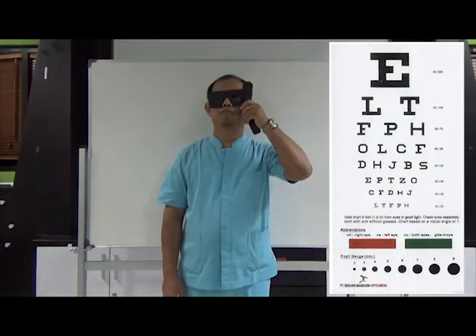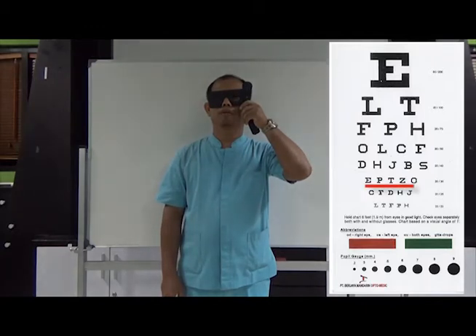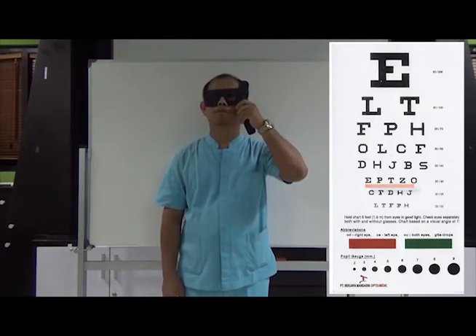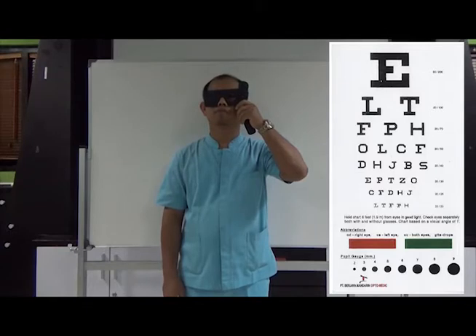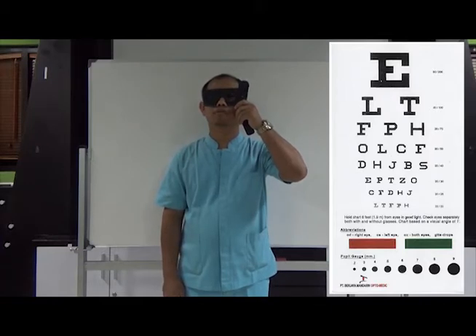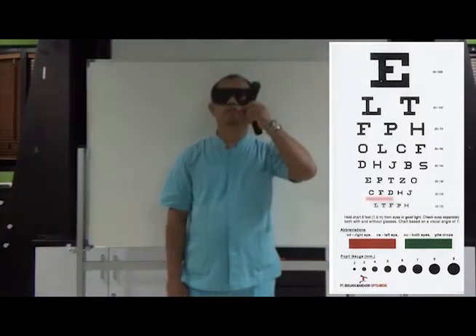Can you please try to read aloud the line that is most visible to you? E, P, T, Z, O. Can you try to read the line under that? No, I cannot read that. Can you please just try? It doesn't matter if you are wrong, and it's okay to guess. C, F, D.